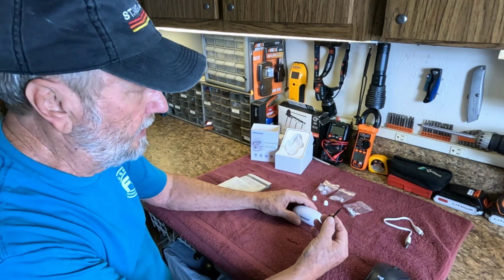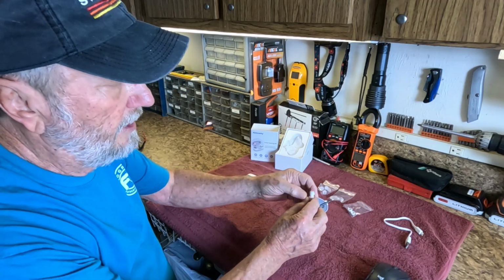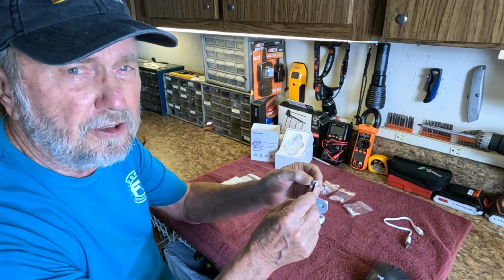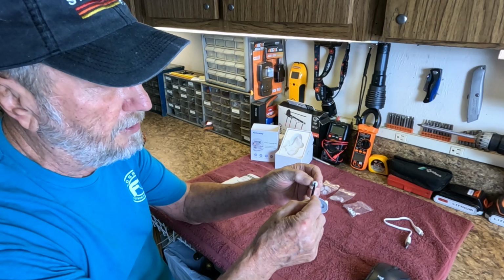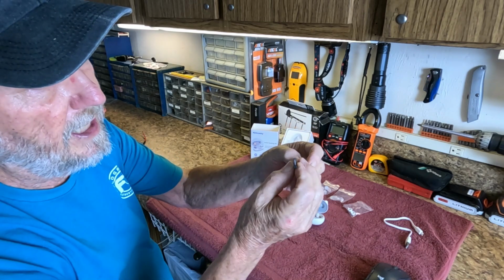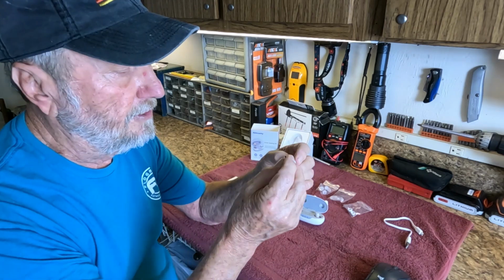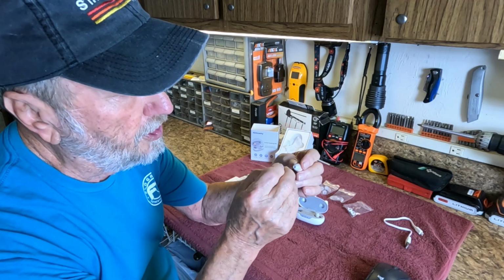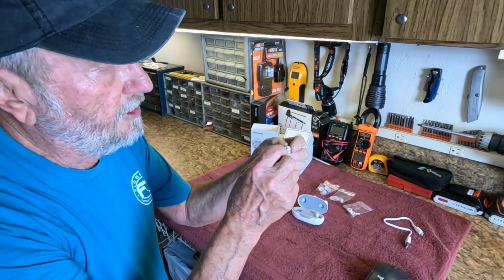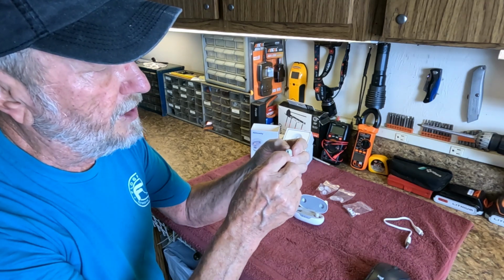Now here is for the cleaning that I just mentioned, and let's just take one out. We all have earwax, and occasionally this area could get filled up, or debris of wax and buildup can develop in there. And here you have a little brush that you can brush that out, because if that fills up, then you're going to lose your ability to hear sound as well. So examine that, but don't push this in. Just clean out the edge of it like that. Don't push in hard on that, because that's the microphone in there. You just want to clean out to be sure it's clear.